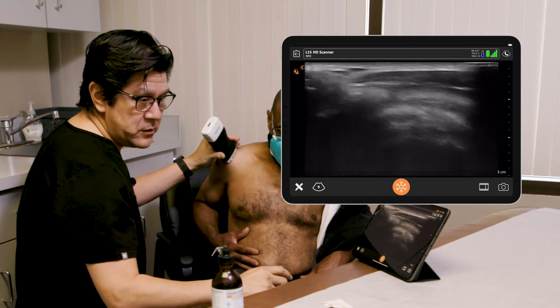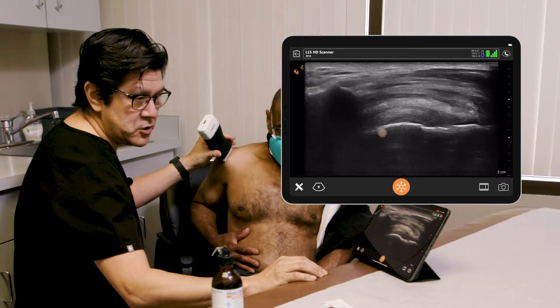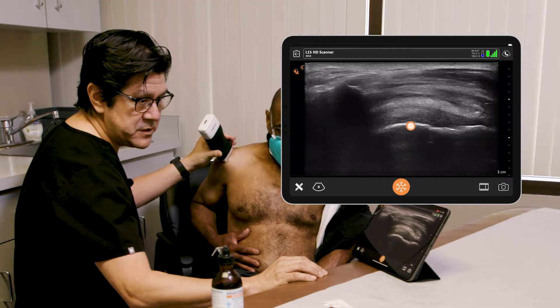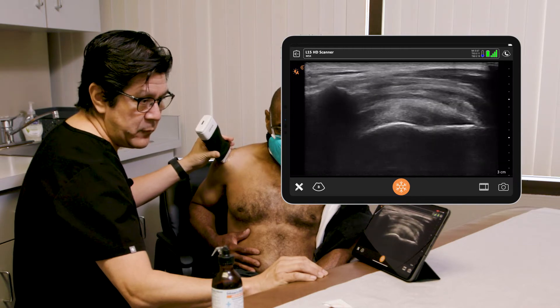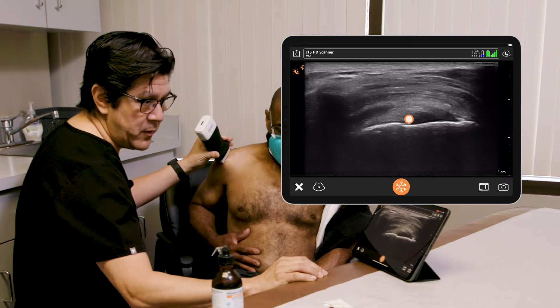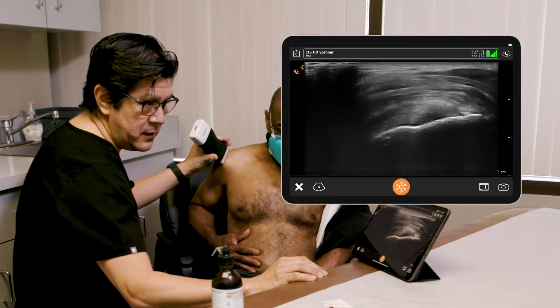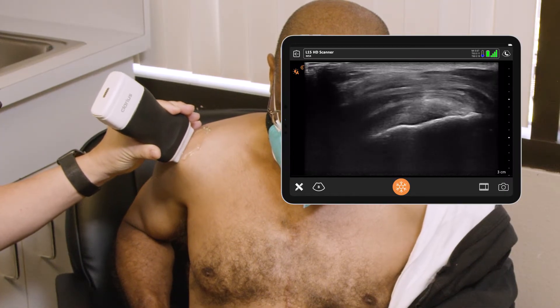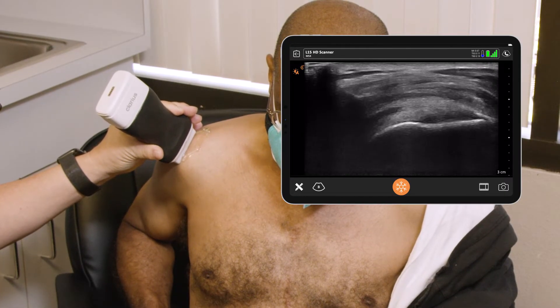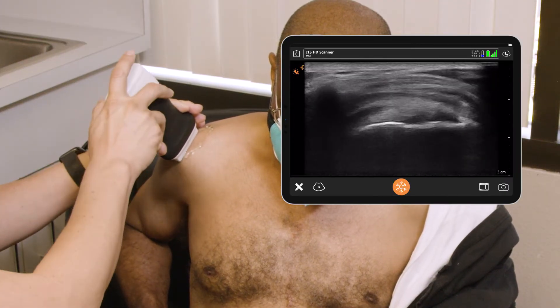We're now going to do the ultrasound and have a look. We're seeing here the tuberosity very nicely — you can see it's irregular, which indicates some chronic tendinopathy and some cystic changes in the bone itself. We can also see a thickened area with some hypoechoic areas on the bone, which might indicate partial tearing right there. Definite tendinopathy, definite swelling. So we're going to get to that subacromial space.